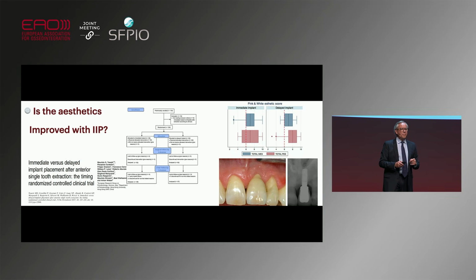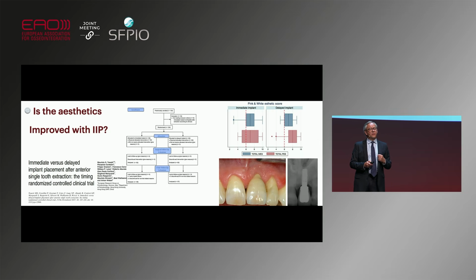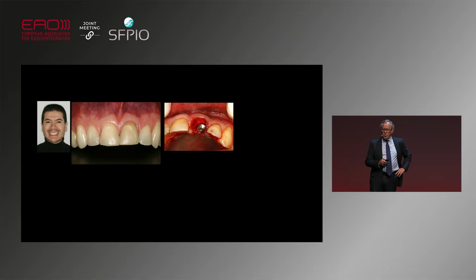And therefore, this clinical trial stated that immediate implant in the anterior maxilla could be an aesthetic risk, and therefore we needed to be cautious when indicating this procedure.